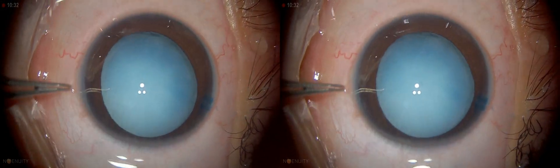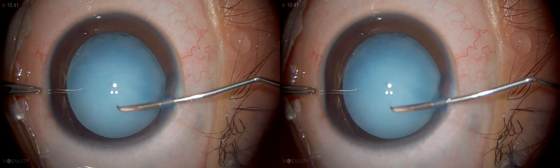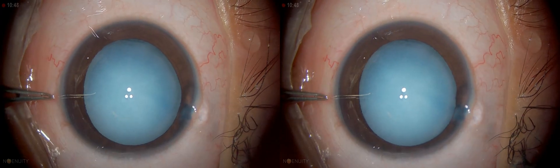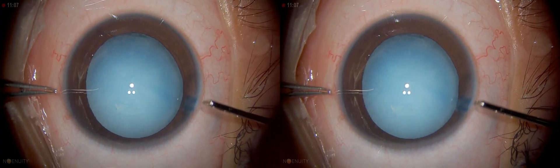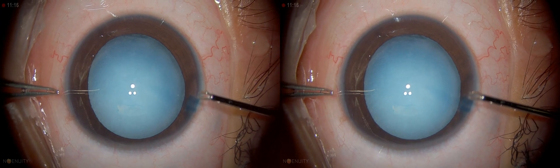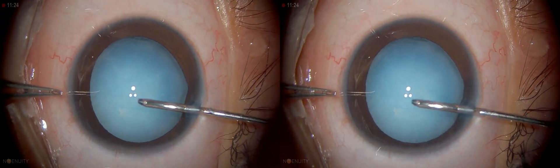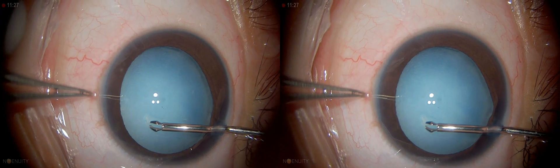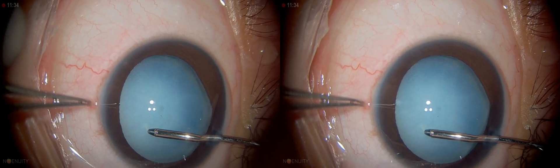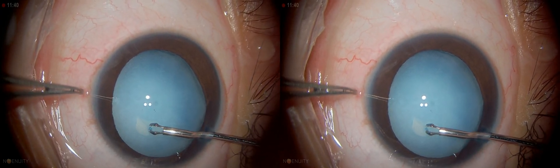You can always rotate this globe in whichever direction you want with the second instrument. This is extremely important. To begin the capsulorrhexis, I make an initial nick like that. Then I use capsulorrhexis forceps — you can see it has a good grasp. It's oriented vertically downward, which makes the capsulorrhexis a little bit easier. If it is horizontal you might have to bend it. I'm going to enter and grab — this is the initial opening.